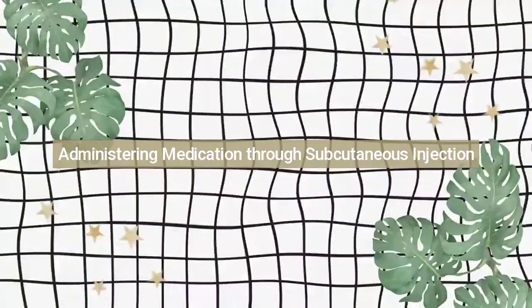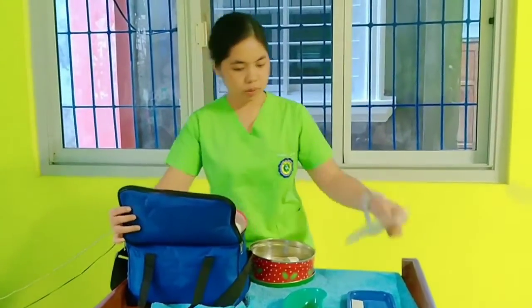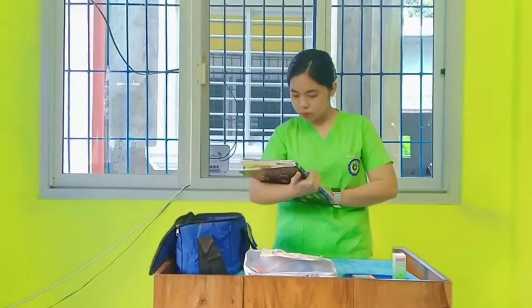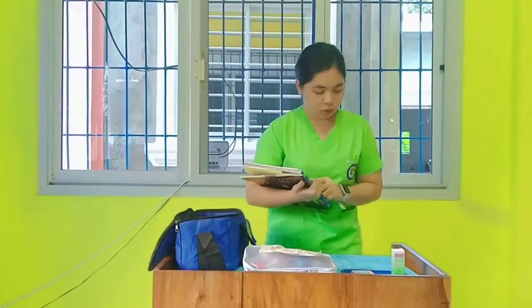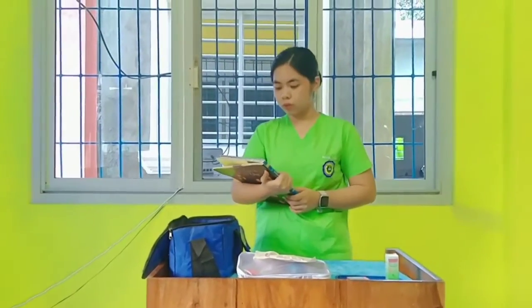Administering medication through subcutaneous injections. Gather the equipment. Check medication order against the original physician's order according to agency policy. Clarify any inconsistencies and check the patient's chart for allergies.